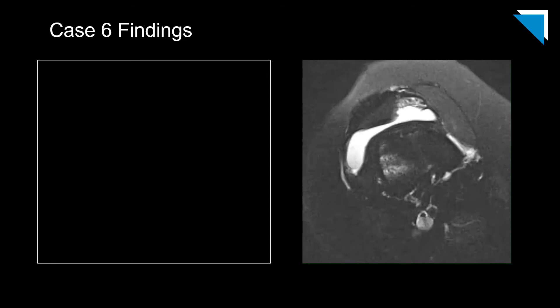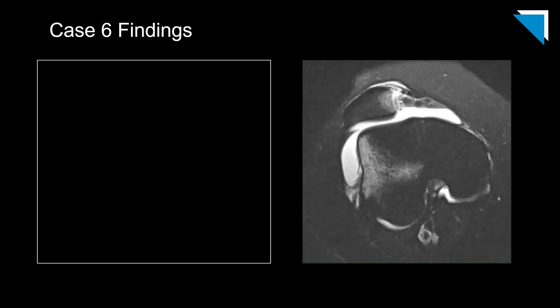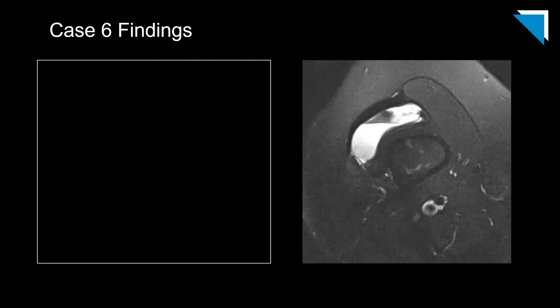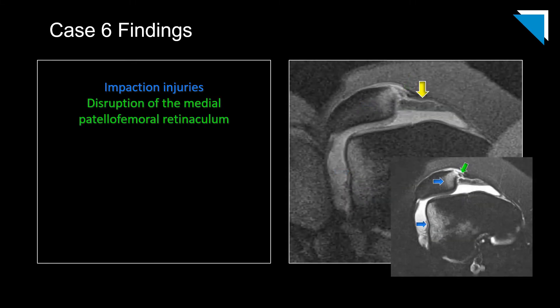These are axial fat-suppressed fluid-sensitive sequences from an MRI of the knee. This single image demonstrates all the pertinent findings: impaction injuries with associated bone marrow edema along the medial patellar facet and the lateral aspect of the lateral femoral condyle, and at least a partial-thickness tear at the patellar attachment of the medial patellofemoral retinaculum.